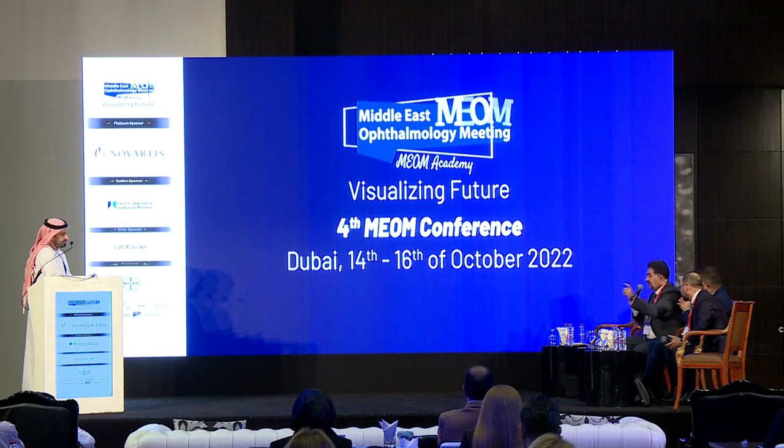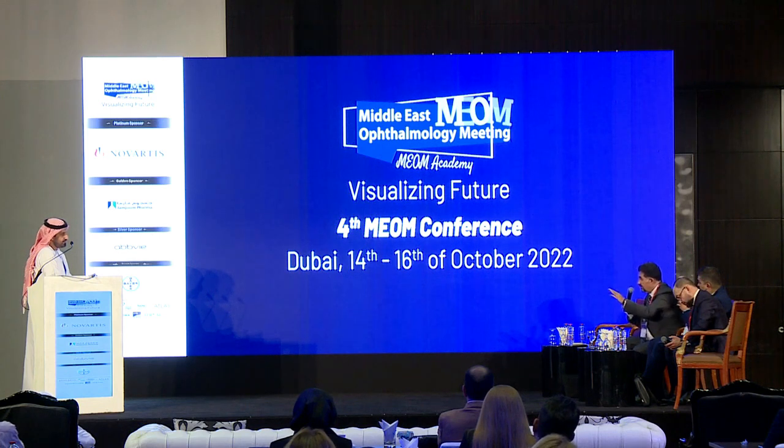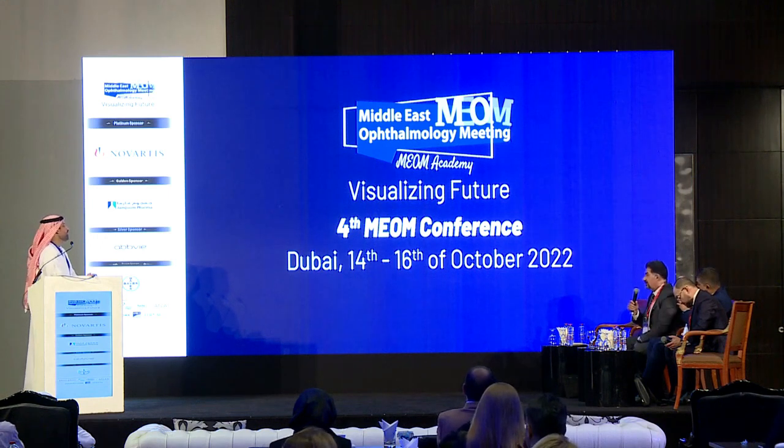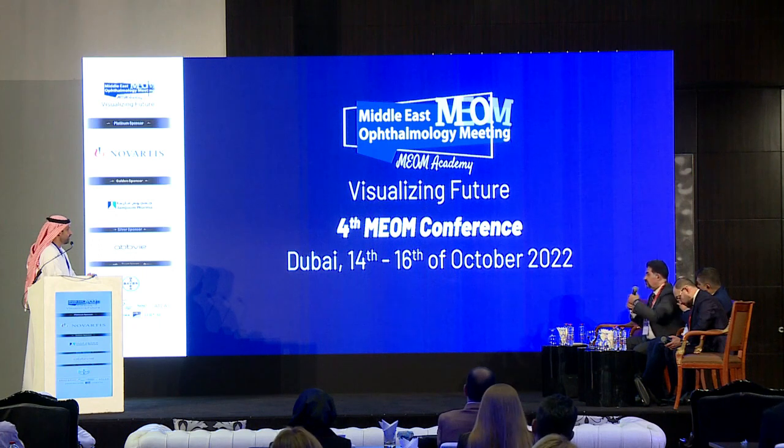So you are going to do a Pentacam after 3 months, and epithelial mapping for sure, to detect that the epithelium is already remodeling again. So if we wait for another 6 months to do another Pentacam and epithelial mapping, it's okay.